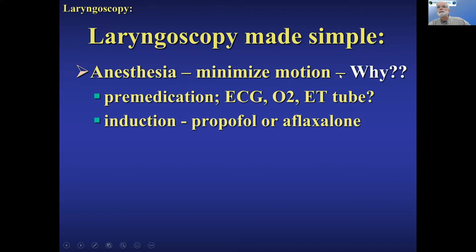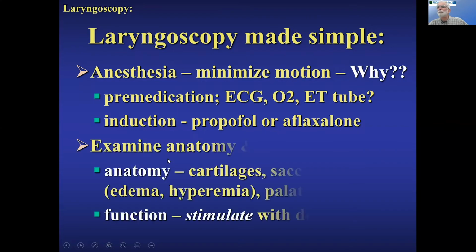If you just anesthetize them and try to hold the mouth open and see things as they're trying to gag and swallow, we used to say keep them light enough that they moved. But we want to look carefully at all the structures before they start moving or we give them drugs, doxapram, to move. So pre-med, whatever your flavor of the day is, hook up your oxygen, have an ET tube ready, ECG, and then whatever your propofol or alfaxalone to induce them.